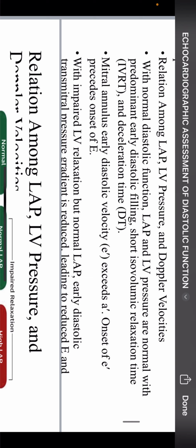You can record both, and they are represented as E prime. This E you are seeing with the prime, and it also has its A, like the inflow, A prime. But this time around we are using small letters, while for the inflow we are using capital letters.